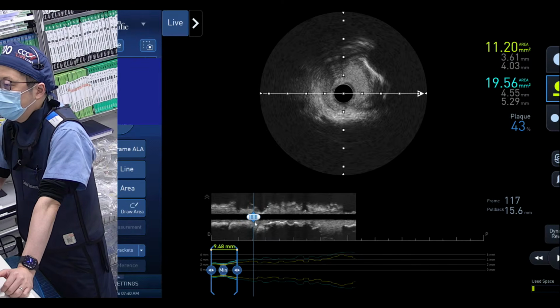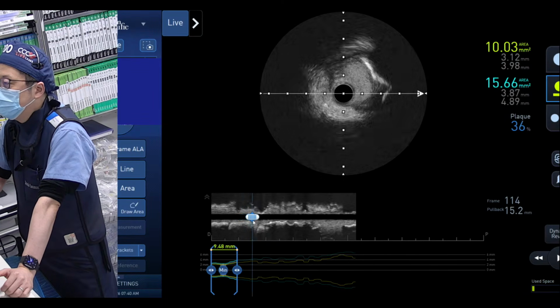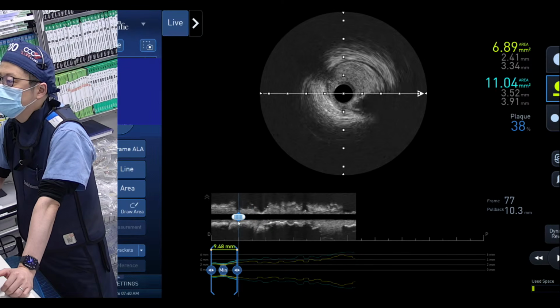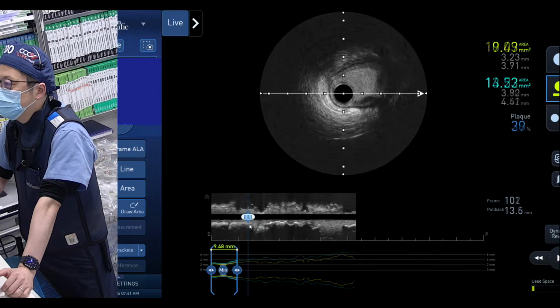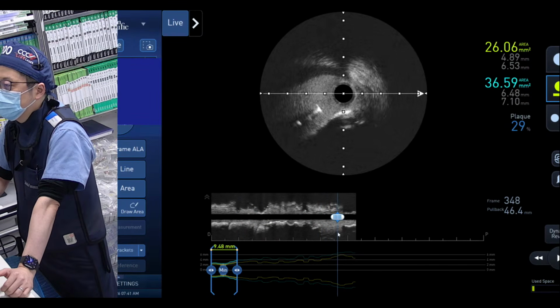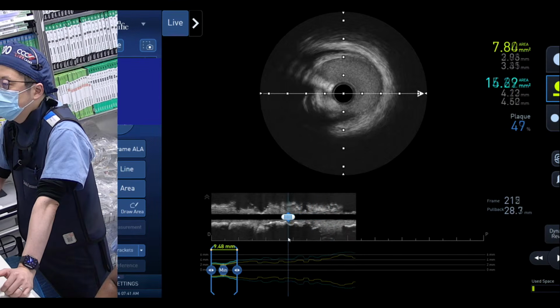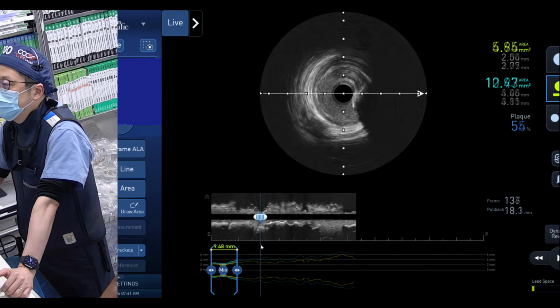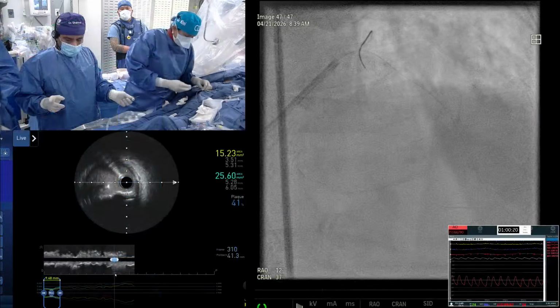Agree? Yeah, I agree. And the other point is the huge size gap between the LAD and the left main. The start of the pullback is less than a 3.5 vessel. And the left main is 5.0? 4.5 vessel with some eccentric calcium plaque. But okay, what we'll do is take a 4.0 and then proximally optimize the left main. 4.0 low pressure. And 4.5. No, what size is the left main? More than 4.5, a 4.5 vessel.